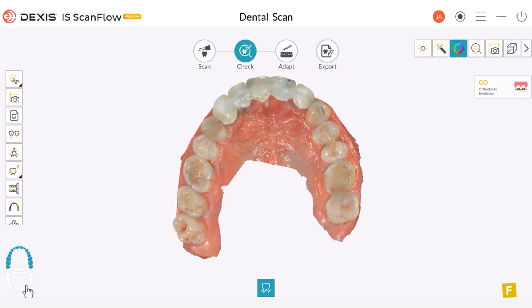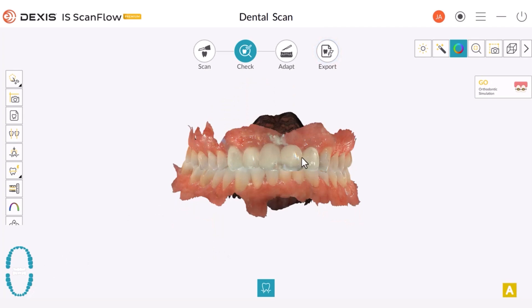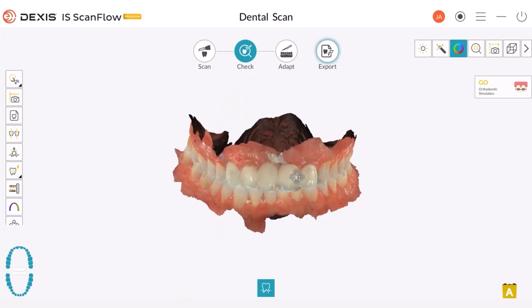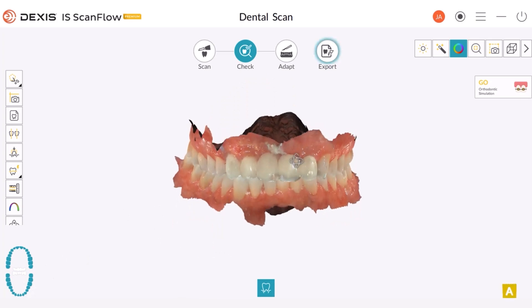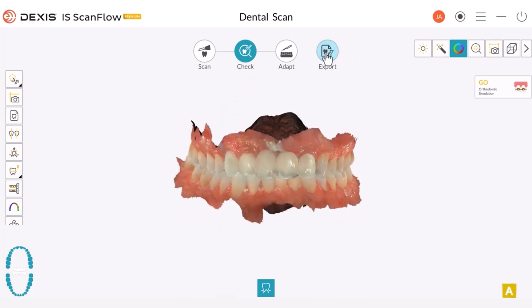Here both arches are back together. You can see that the scan looks good. When you're satisfied with your scan, you have two options: you can either click on the Export button and use it as Connect, or simply save the scan by clicking the Close button.